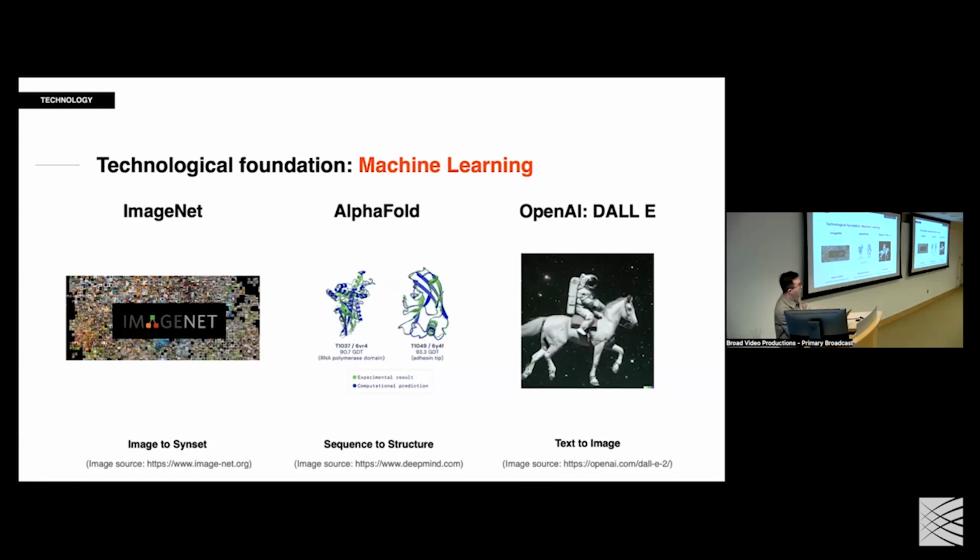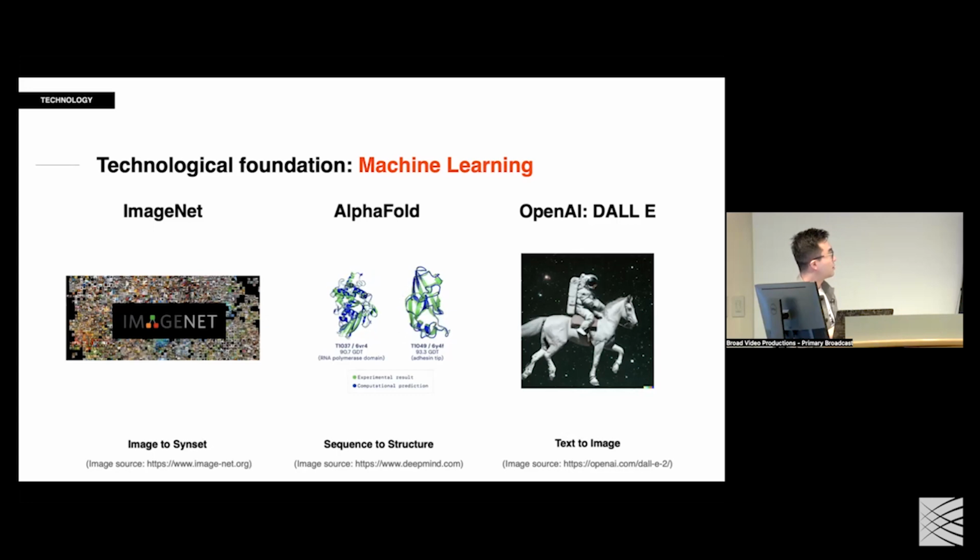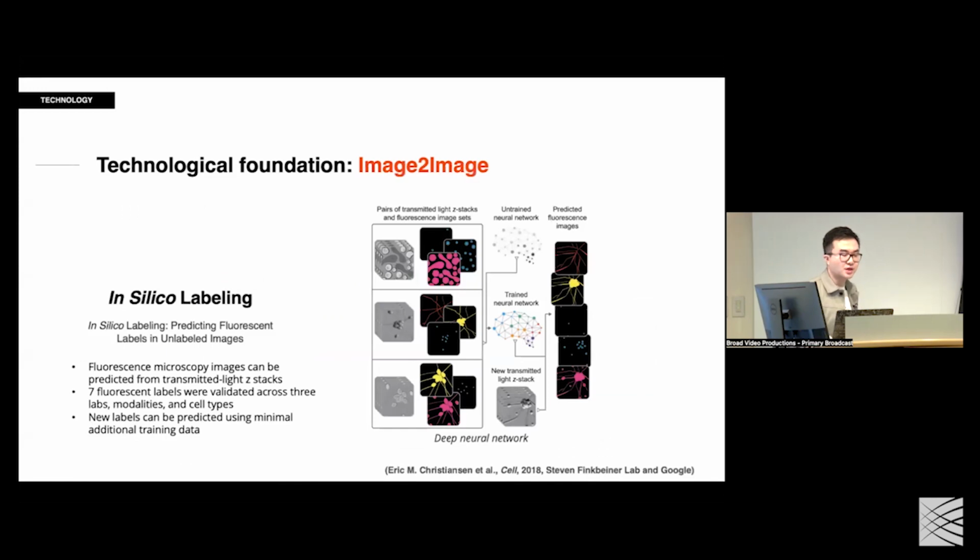But all of these share one thing in common. They're doing a translation problem like the one we are trying to do. In ImageNet, they were trying to translate the imaging information into labels. From AlphaFold, they're trying to generate the structure from the sequence information. And for DALL-E, they're trying to translate the text information into imaging data. For AlphaFold and DALL-E, both the sequence and the structure are describing the same object, and the text and the imaging are also describing the same information. That's why we started to ask, can we actually translate the imaging data into all kinds of omics data?